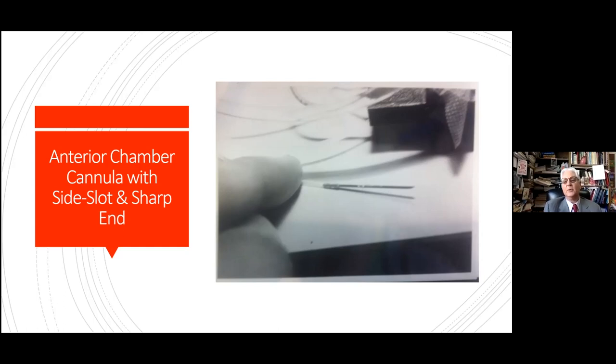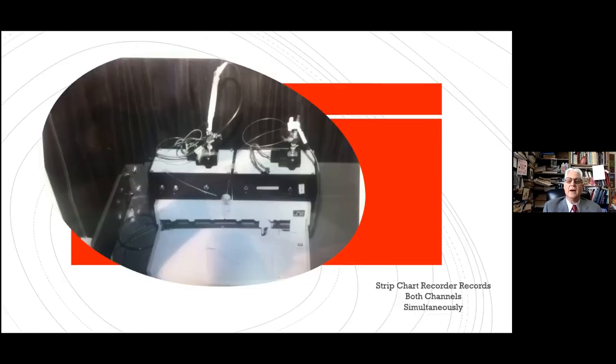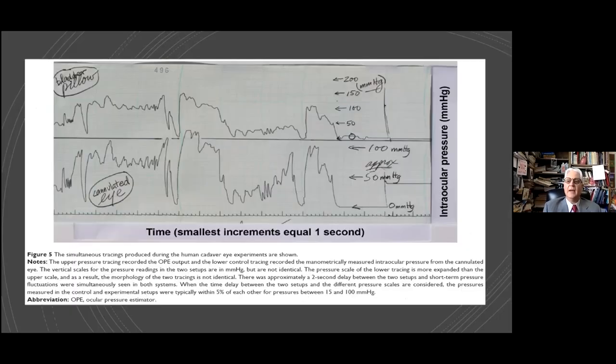And then there'd be a fluid continuum from within this slotted needle through a high pressure hose all the way back to the transducer. So now you have a system where you have two channels. One of them is the pressure pillow, the bladder, and one of them is the cannulated eye. And then once you have them zeroed out, you could compare one to the other.